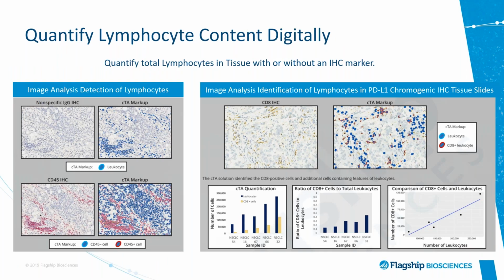Another advantage of our technique that I was trying to illustrate earlier is the ability basically to define and detect specific cell types in absence of immunohistochemistry.